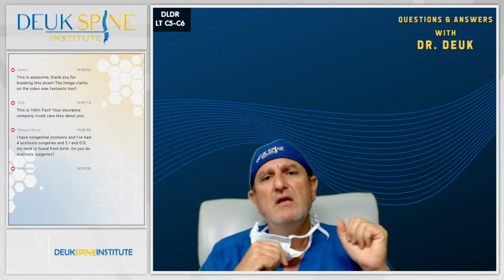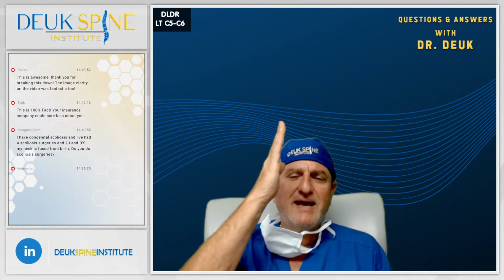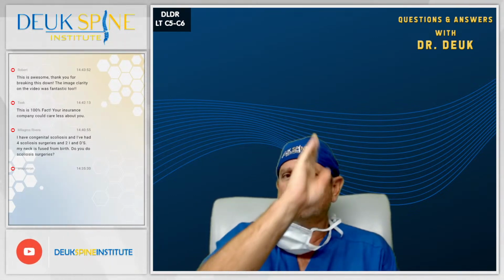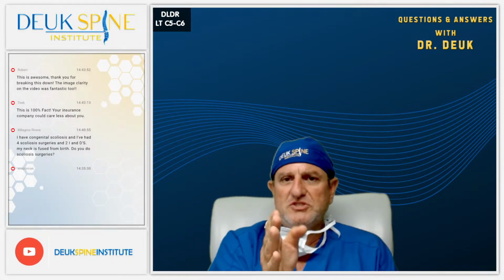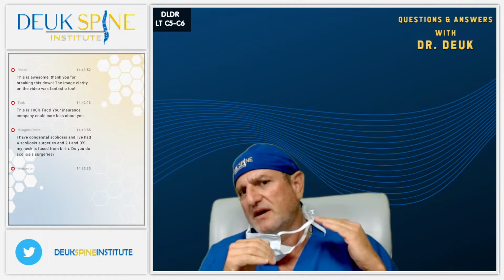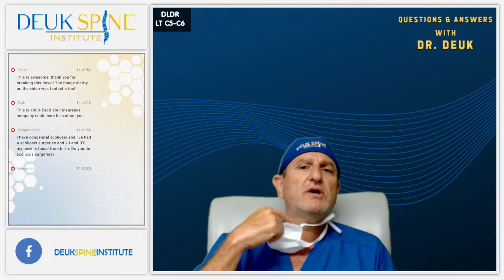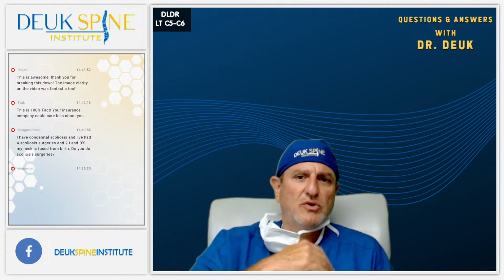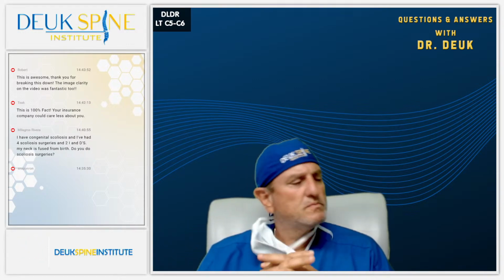I think it's fair. For those of you who don't know, the sagittal view is I'm slicing like this through the cervical spine or lumbar spine, kind of going from side to side while the patient's looking forward, and then looking in there at the spine from the side view. The axial view is like chopping it a different way, but looking through the disc, seeing the herniation on the axial view. We'll try to do that for you. Thanks for the advice.